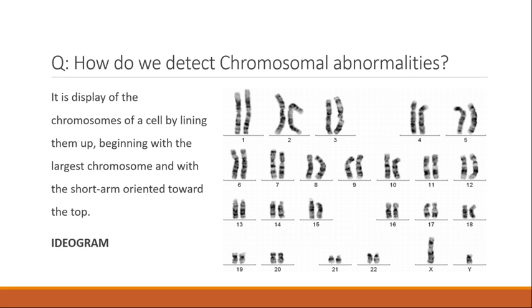Now what we do is, during the sample collection, the cells are obtained and grown within a lab-based setting. From these cells, the chromosomes are obtained and observed under the microscope. Using staining, if we have a visible structural change or visible phenotype of that genetic condition, then probably we'll do the staining method. But apart from that, if we want to see whether there is any chromosomal deviation from the conventional visible chromosomes, then we'll do the karyotyping.